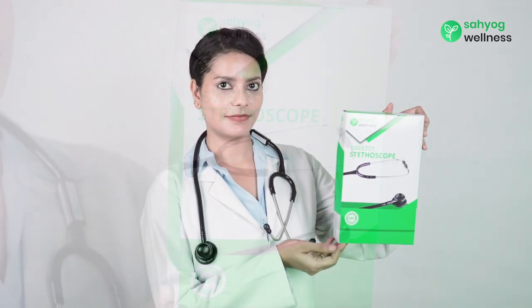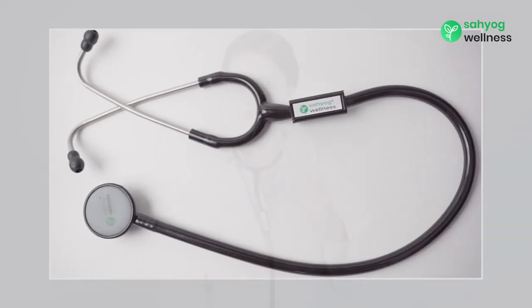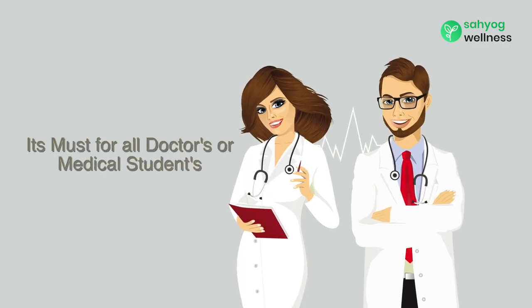Introducing Sehyog Wellness High Quality Acoustic Stethoscope. A stethoscope is an instrument used for listening to the action of the heart and lungs. It is a must for all doctors and medical students.